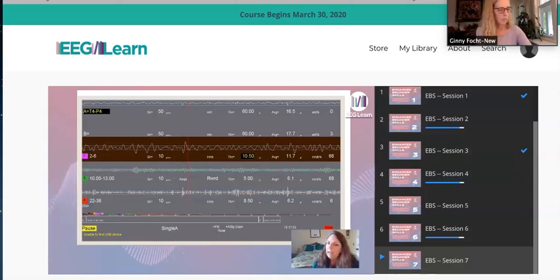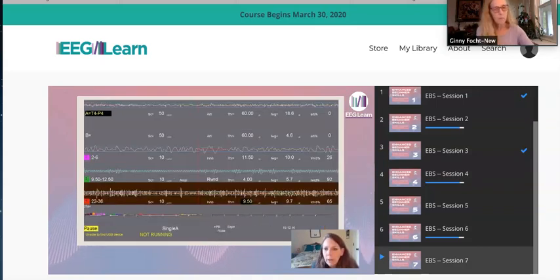So we don't want that activity going up too high. And if it is, sometimes you have to stop and check in with the person, right? Anyway, that was a long-winded explanation, but in this set of numbers, the slow wave would be the target of my training.